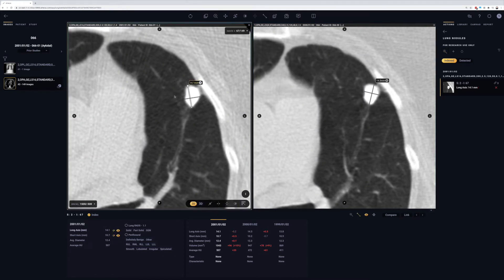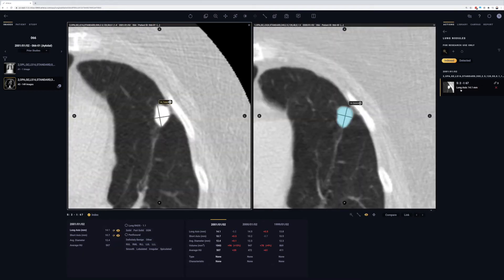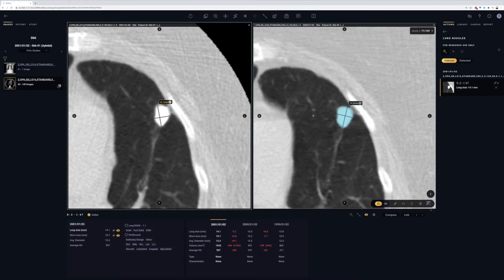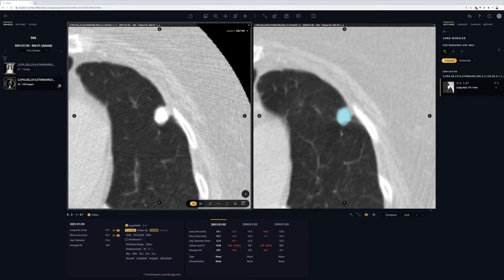It calculates the long axis, short axis, and volume, and if you don't agree with the AI inference, you can simply drag and drop the points.